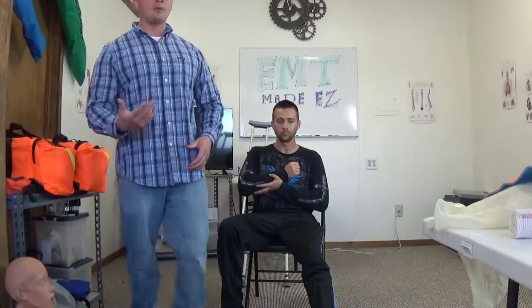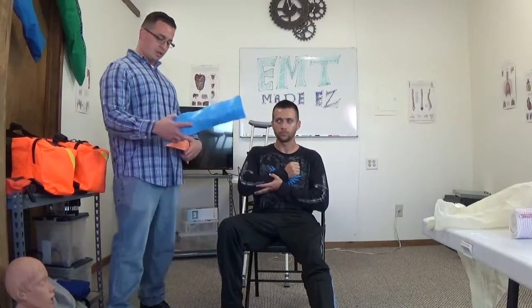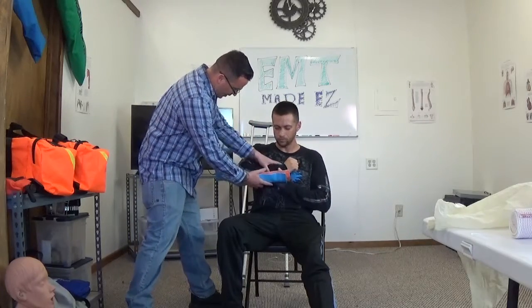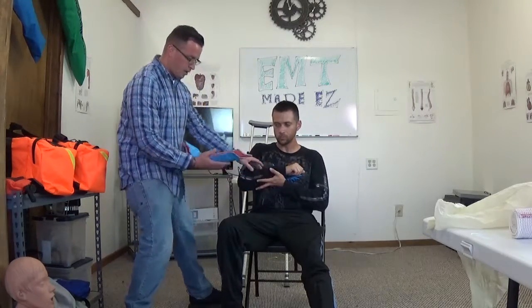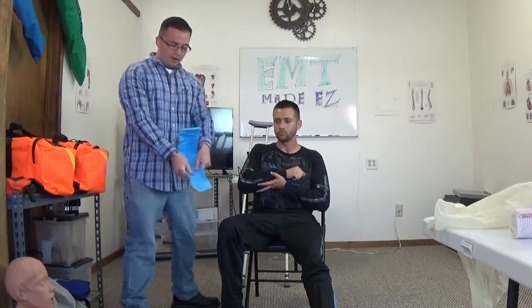Next you want to get your appropriate splinting material. For this patient, a regular Sam splint is going to do just fine. I'm going to measure it up against the affected arm to make sure it's going to hold in place. I'm going to mold it to make sure it's stabilized by folding it into a U shape.